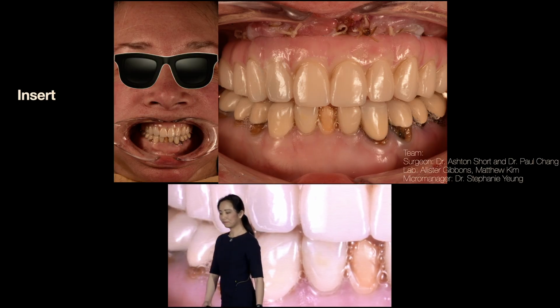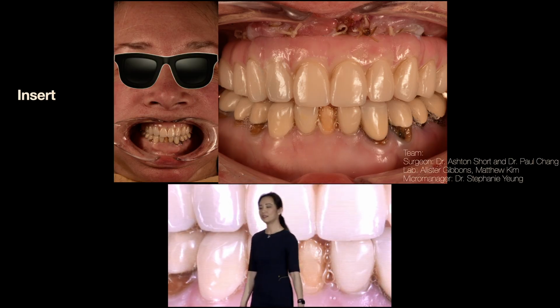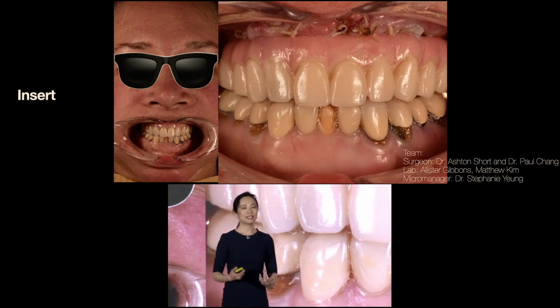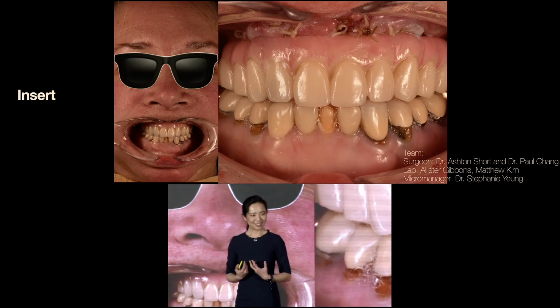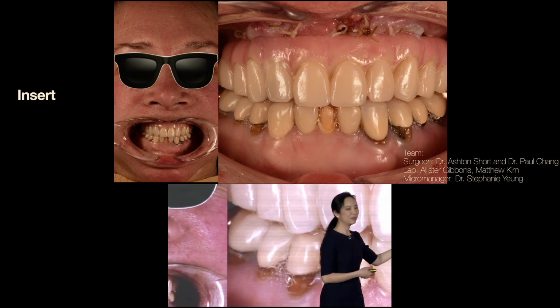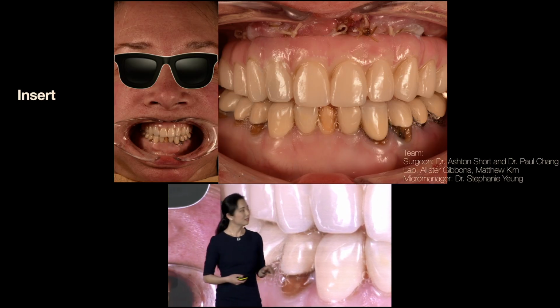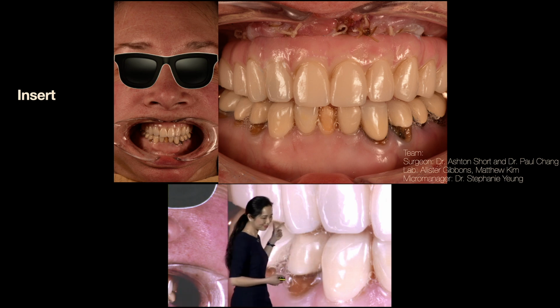What you're seeing is that basically I've retitled myself as a micromanager across all these slides, because at this point, I hope you're seeing that all this heavy lifting was done at the very beginning of the case. All I'm doing is basically going through every motion with everything already planned out on my end. The only variable that I'm really working around is how the surgery goes and where the implants are placed.